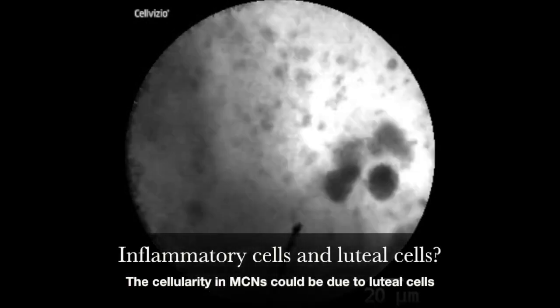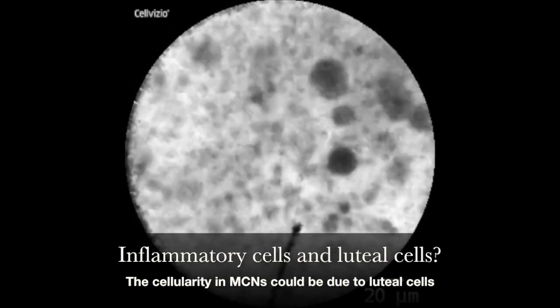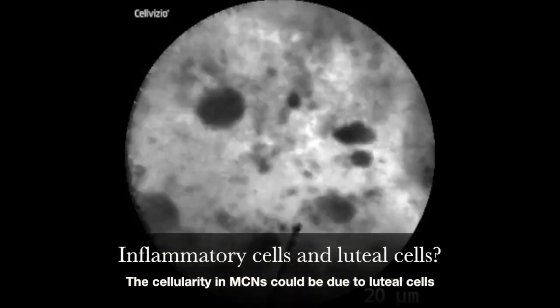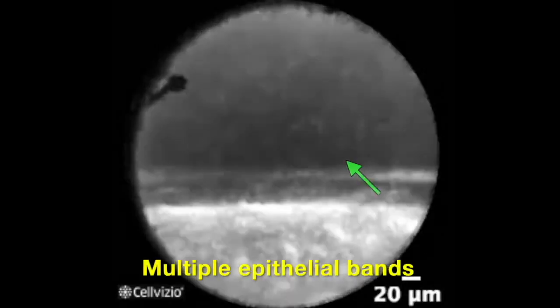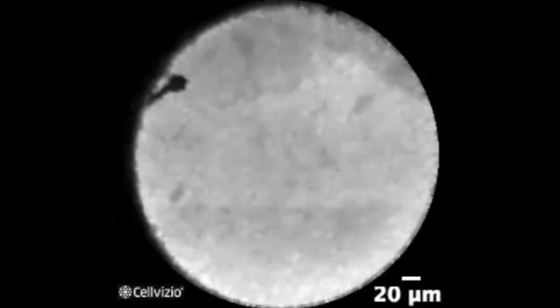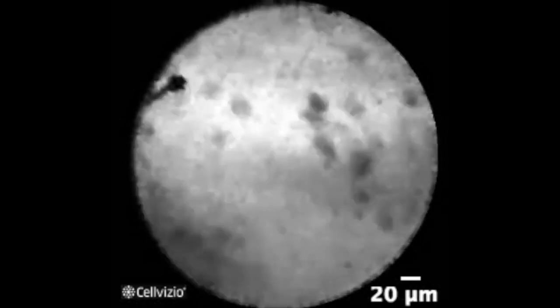Occasionally we see these large, round, isolated cells which we think are luteal cells, which are a feature of the ovarian stroma. But MCNs demonstrate both these large cells and clusters of clumps of inflammatory cells. Again, more examples of epithelial bands seen in cystic neoplasms.